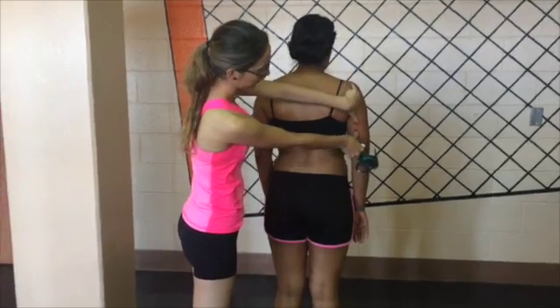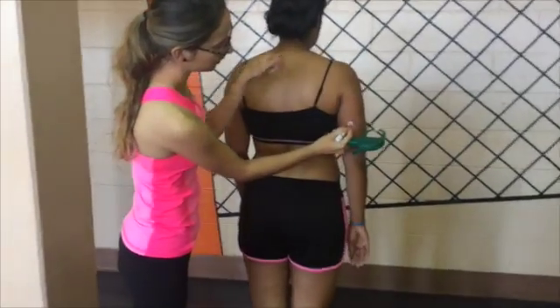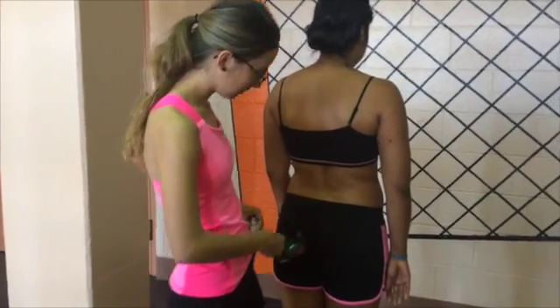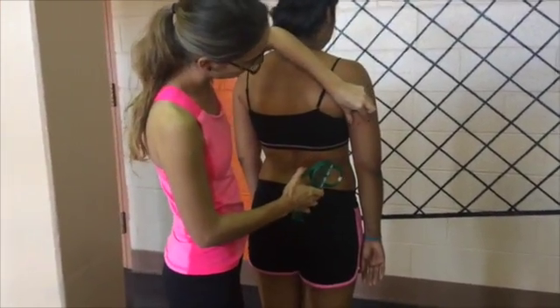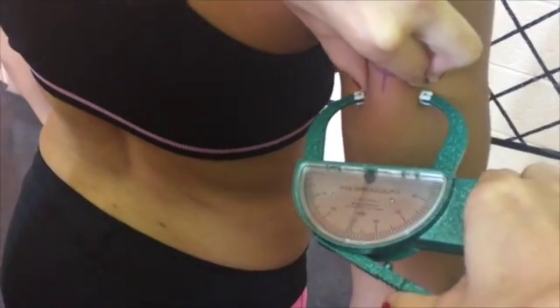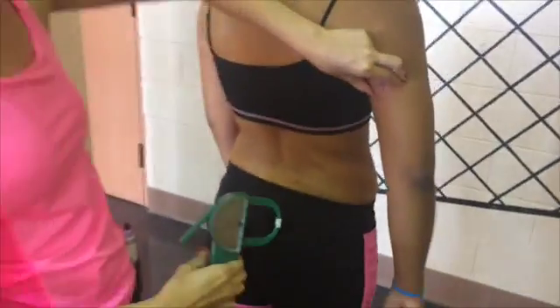The first measurement we are going to take is the tricep fold. It is located on the posterior midline of the upper arm, halfway between the acromion and the olecranon processes. Take a vertical fold with the arm held freely to the side of the body.